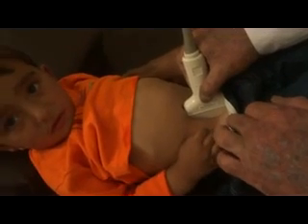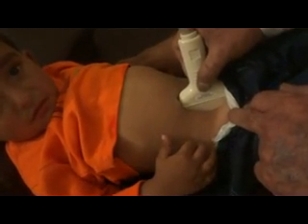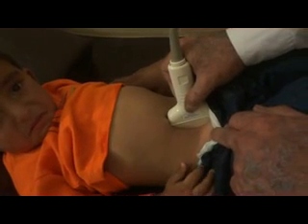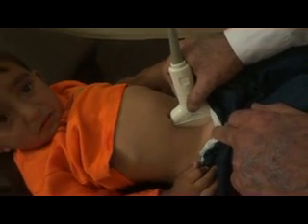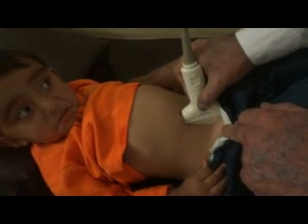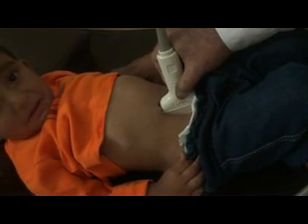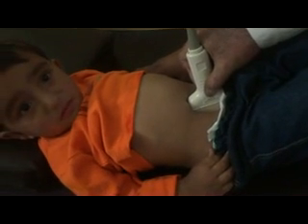Second thing that you will be seeing in the kidney of a 2-year-old child is that the pyramids will stand quite prominent. See, this is the medullary pyramid, this is the pyramid, this is the pyramid. So the pyramids will stand quite prominent. So this is a normal kidney.